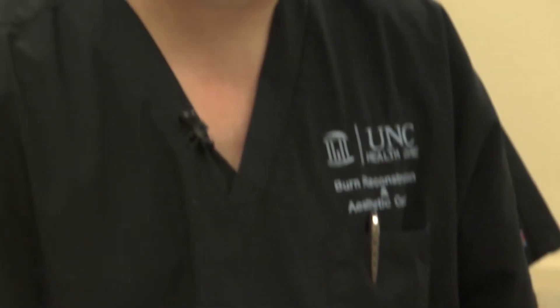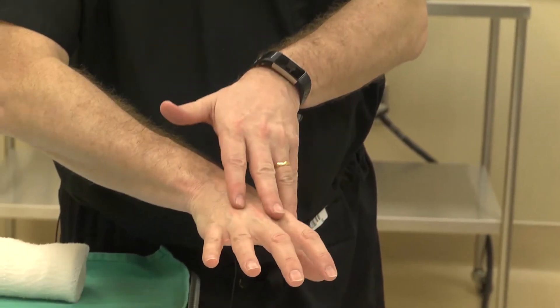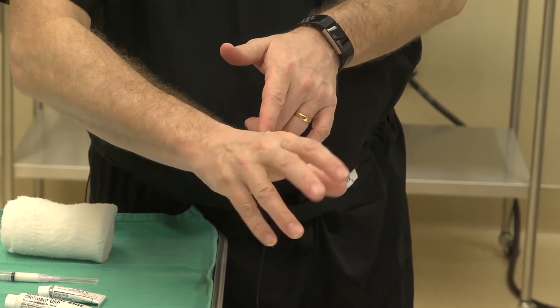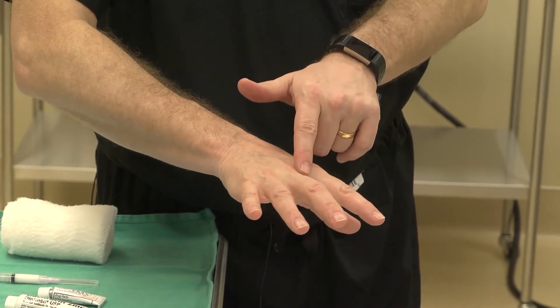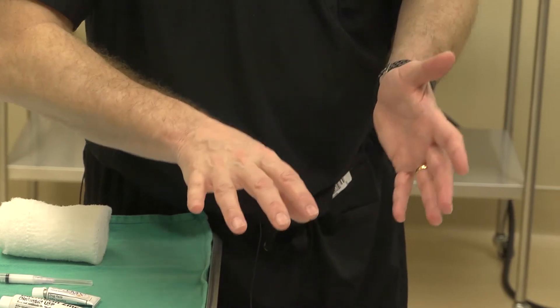He might have an excellent response to the laser and need no surgery. Currently, he has little web spaces that have extra skin. To release these contractures and let him move his fingers, you might need a skin graft. Our hope is that by lasering these tight bands, we can just move the tissue around and not have to use a skin graft.